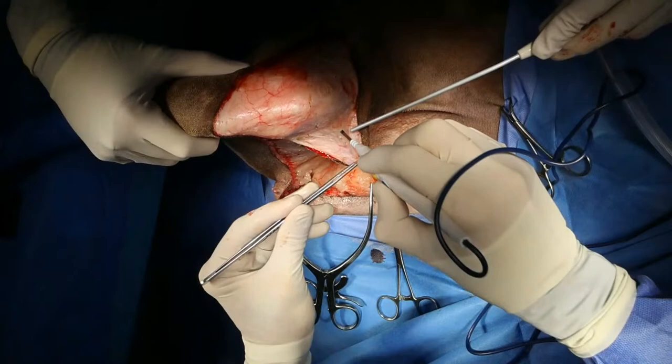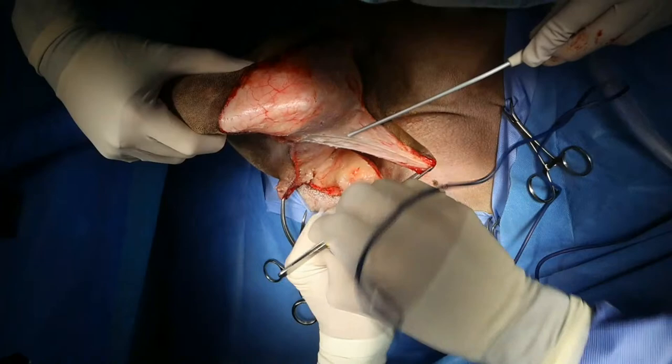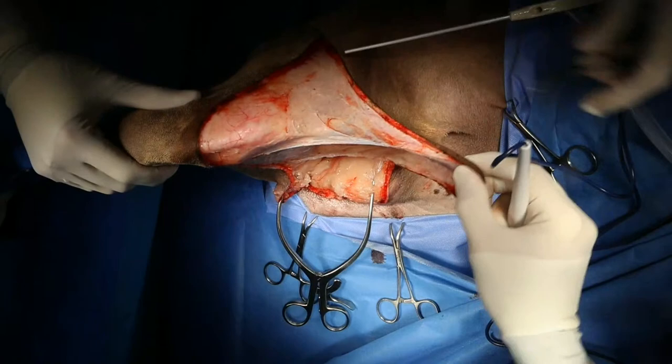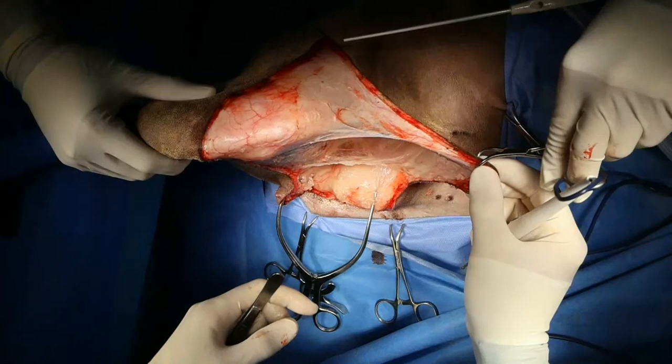And these are quite fun surgeries, because you really have to know and review your anatomy before you get in there, and it's something that we don't do every day. And so you want to make sure that you review your anatomy before you try anything like this. So I've got this huge flank fold flap here.